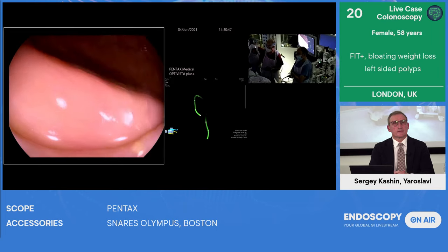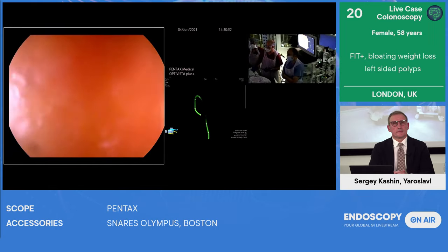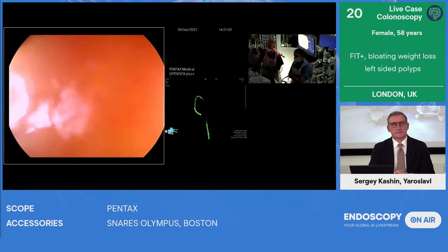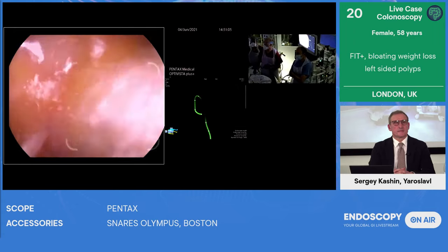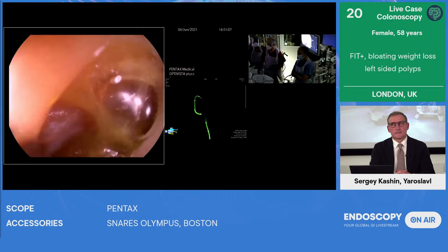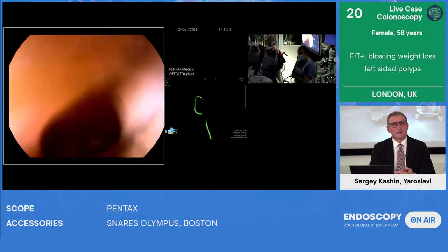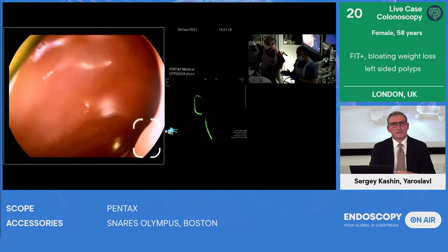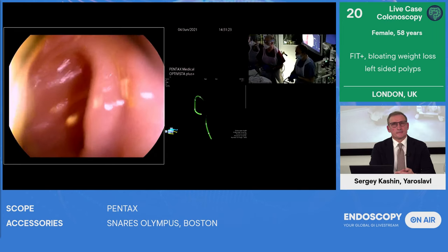And Ed, do you want to comment on the capsule? Why was the capsule done? Why not a colonoscopy? Sure. So colon capsule, I think, is sort of finding its way in investigation of lower GI symptoms. And for low-risk patients, so a FIT of 19, we would anticipate the colorectal cancer risk is in the order of 1% in North London. And so for most patients, we would expect that they would have a colon capsule, it would be normal, and then no further investigations would be required.